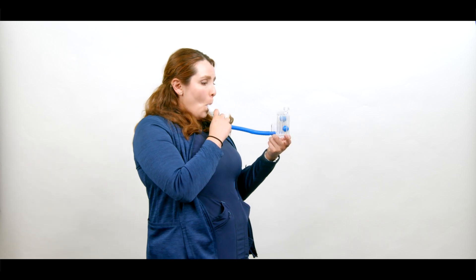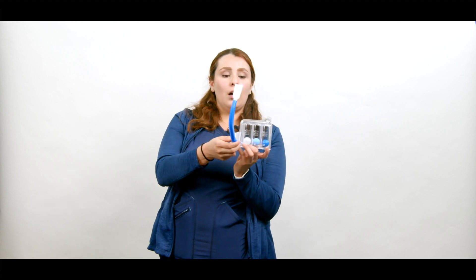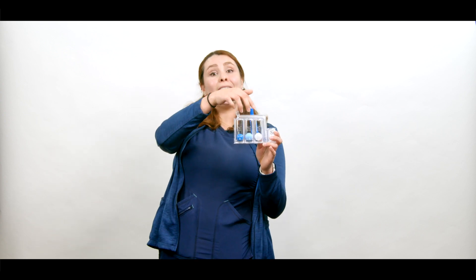So now we're going to practice. First step: place your mouth on the mouthpiece, then remember — slow and deep inhalations. As you can see, the air went all into the tube and the three balls lifted, and I held them for three seconds. That's a good exercise.